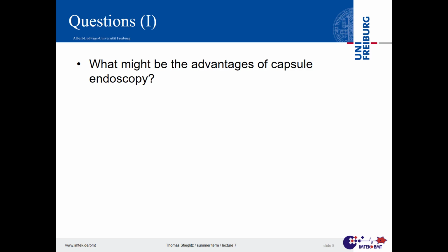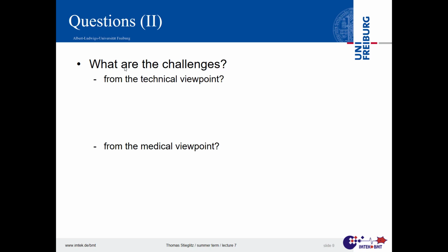And do we have some tools that endoscopes have? If I see something that should be removed, that's a kind of a metal ring, you put it around, just pull it apart, and a little bit of electrical current, high frequency current, to stop bleeding, for example. Those were ideas over many years. And of course, the challenges, as I already said, we have to know where it is, our submarine.